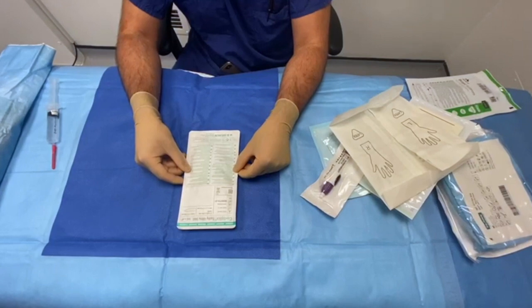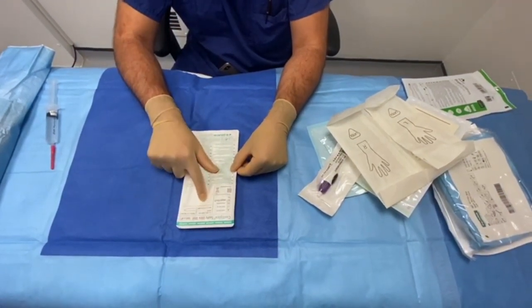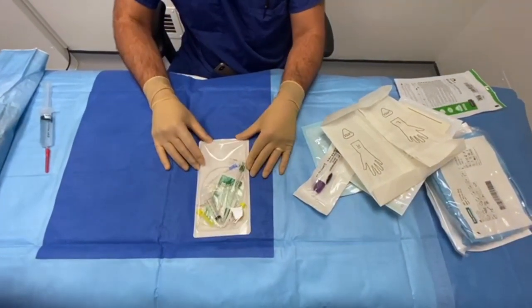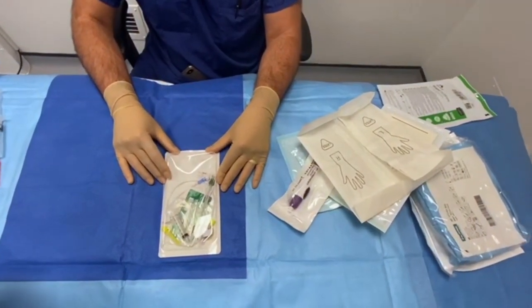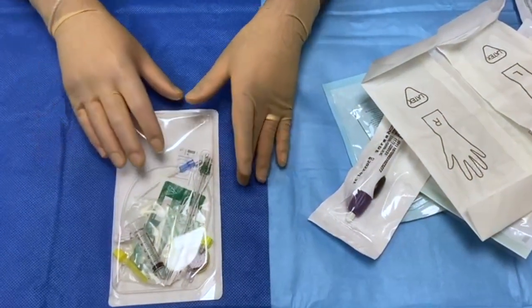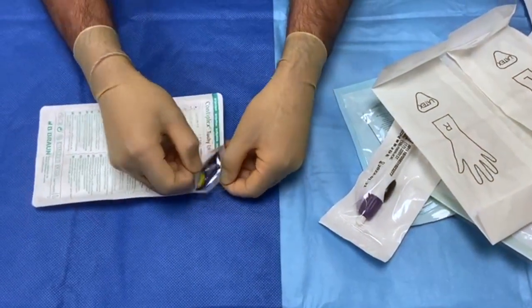This is the Contiplex Tuohy Ultra Set — it's an 18 gauge Tuohy and a 10cm needle. I'm going to show you how I assemble it to get it ready for siting a catheter. Obviously I do this in a sterile manner.